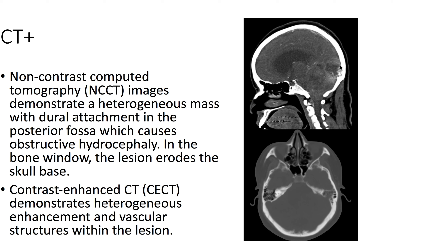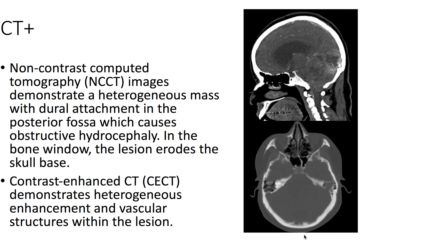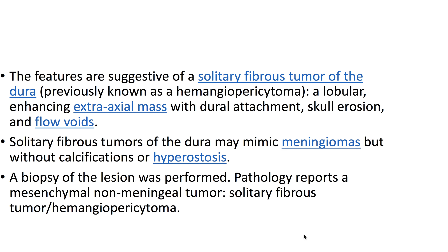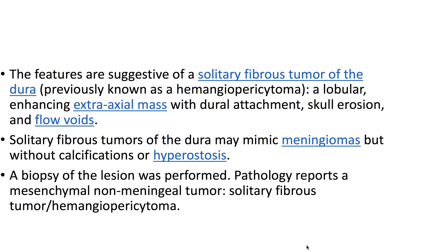On CT with contrast, we again see this heterogeneous mass with a dural attachment in the posterior fossa. With contrast, we can see vascular structures within the lesion. On bone window, you can appreciate that the lesion erodes into the skull base.